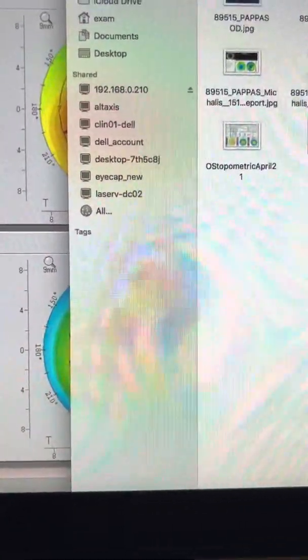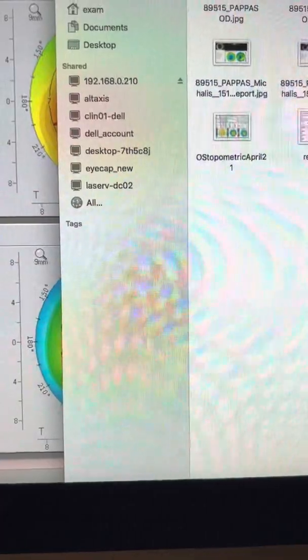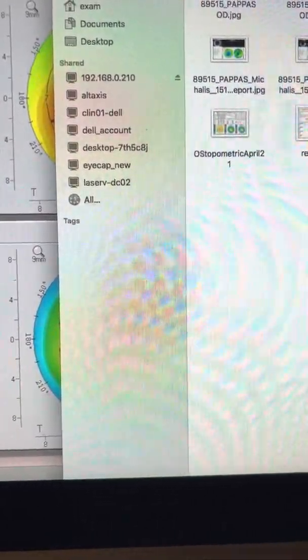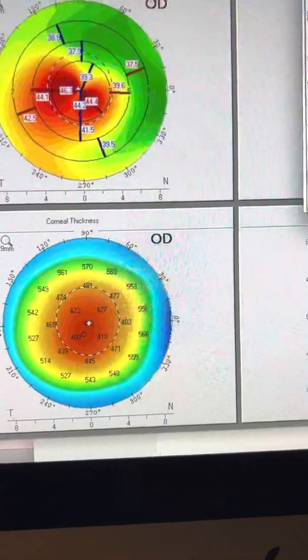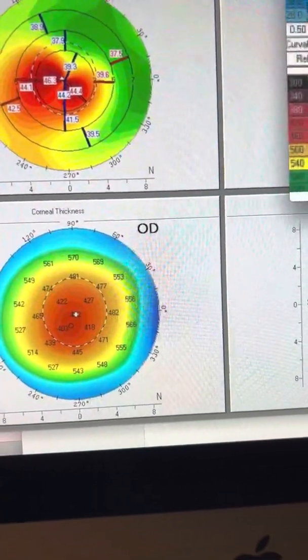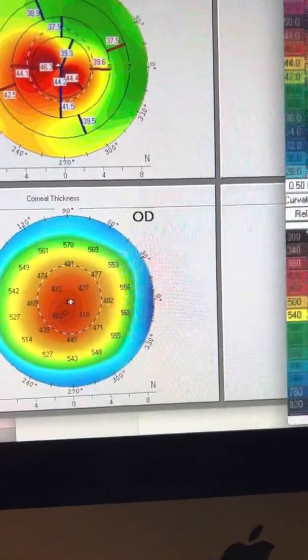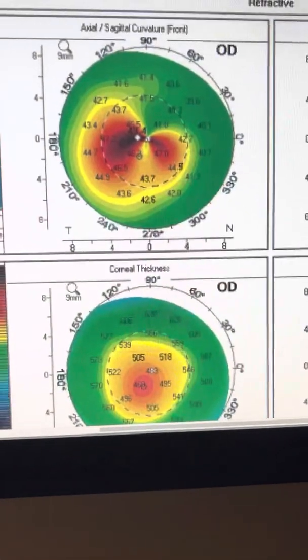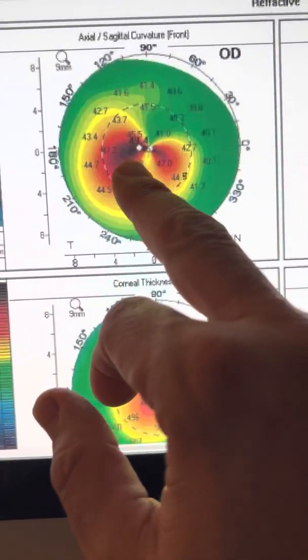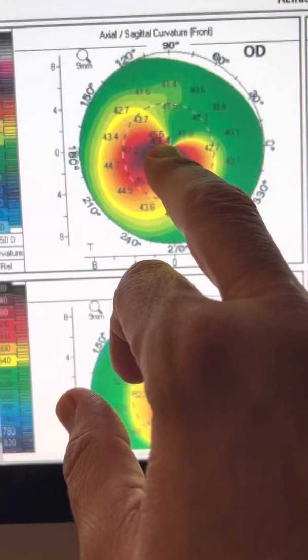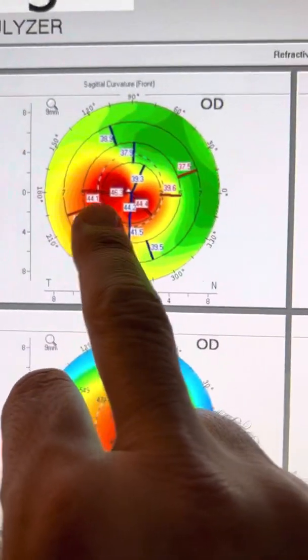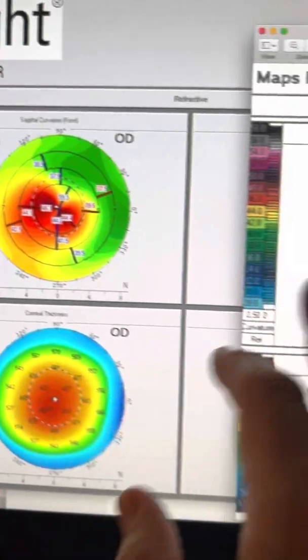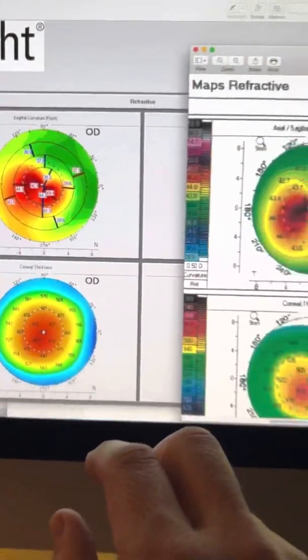And we will also look at the right eye pre-op, which is right here. So we're going to do a back-to-back comparison between how the right eye was and how the right eye is. And this is very interesting for us, as we can see that the steepest K was 49.4 here on the right eye, and today the steepest K is 46.3.